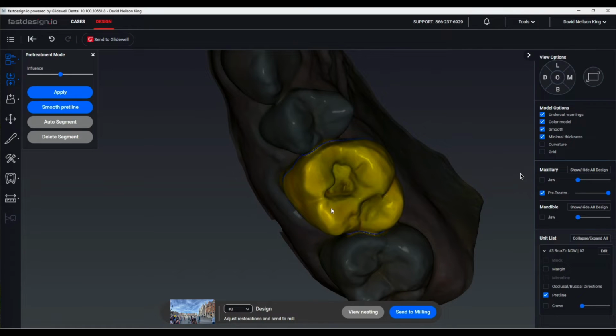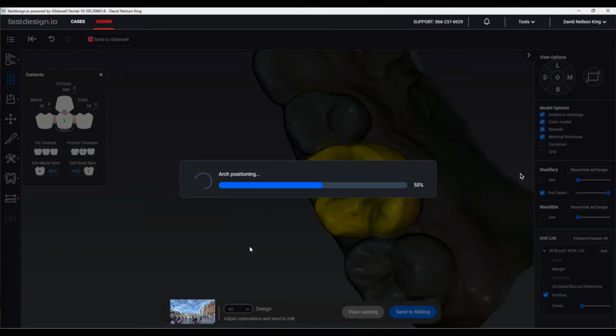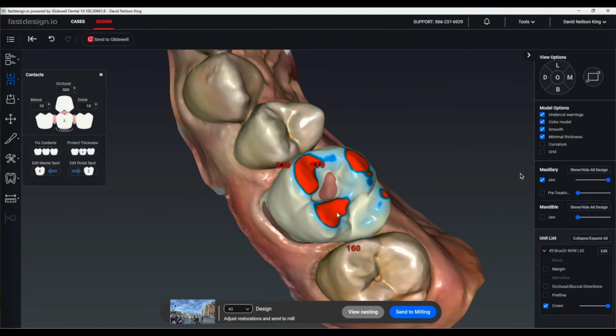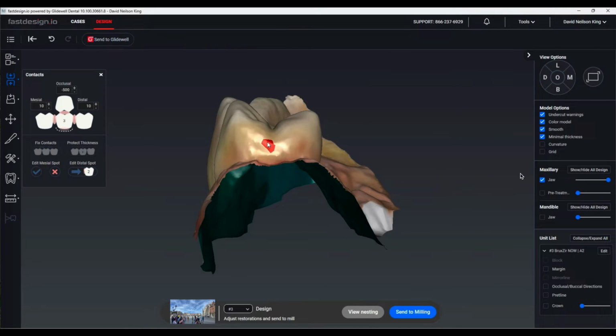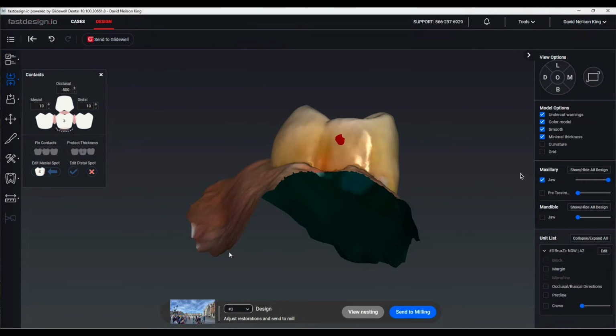Yes, there's a little bit of unevenness there, so I am going to adjust the inside of her prosthesis a little bit, but I'm going to leave that alone. So I'm going to hit Apply. What it'll do is give me a proposal based on that. And then I'll edit the contacts like we normally do. You can see it's a little too thin here. We've got some thinness there. So I'm going to fix my contacts. I'm going to edit the mesial, create a little broader contact there. That one's okay. Let's check the distal.